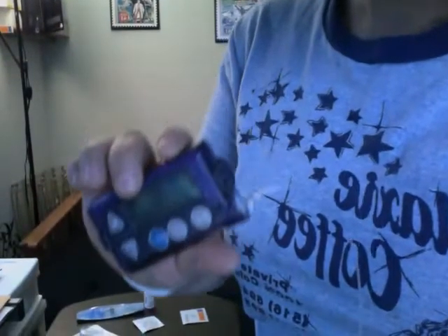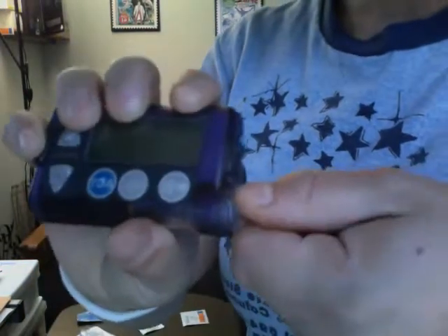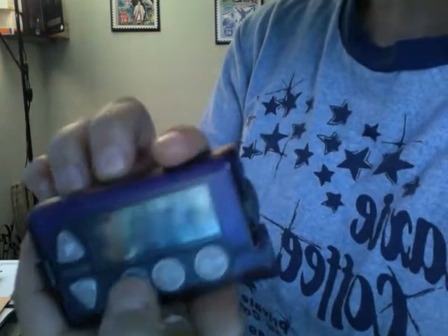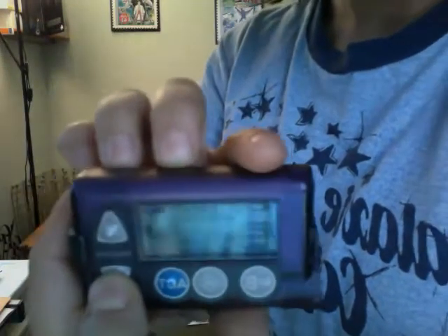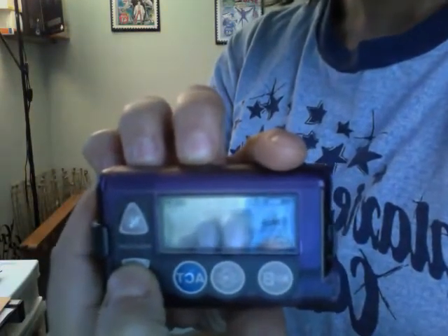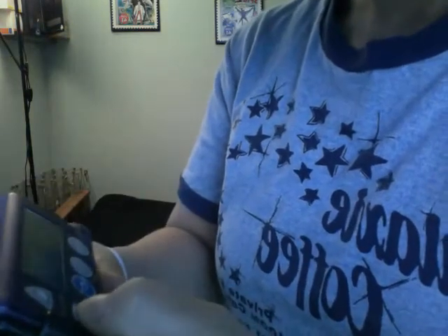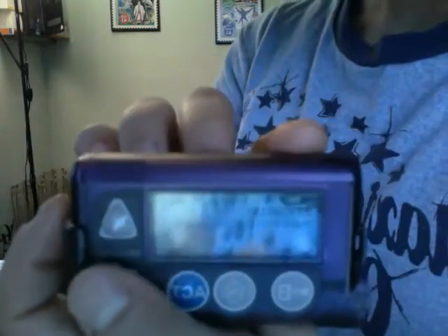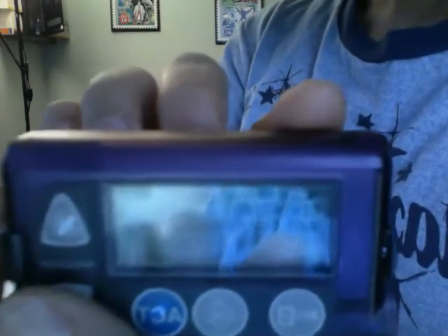Hi, so today I'm going to show you how to change the reservoir on your MINIMED Paradigm pump. The first step is to take the reservoir out and to rewind. Now the pump is rewinding, and while it's doing that, we'll get our new reservoir ready.